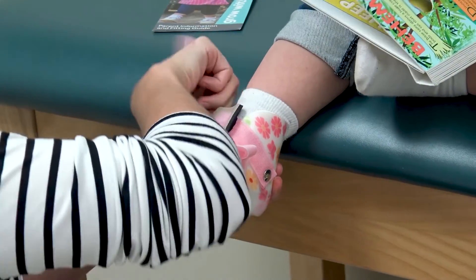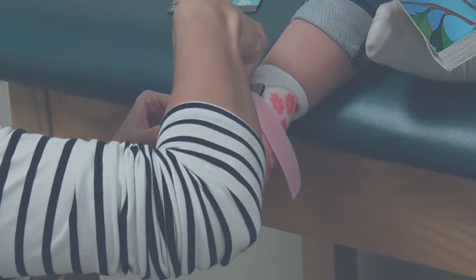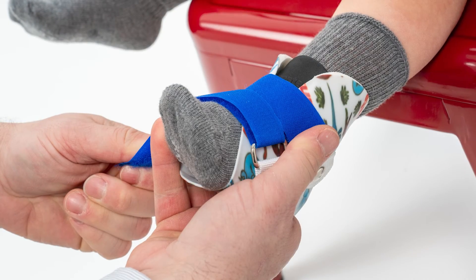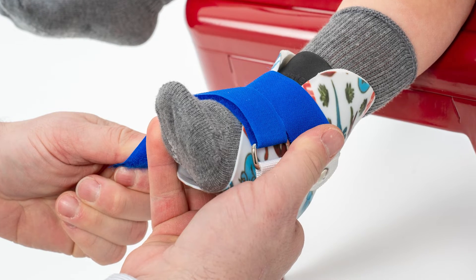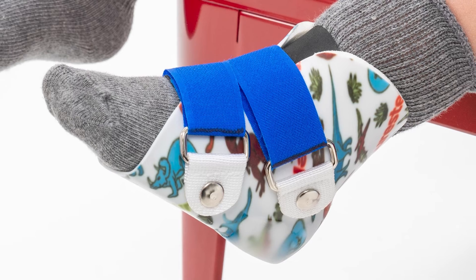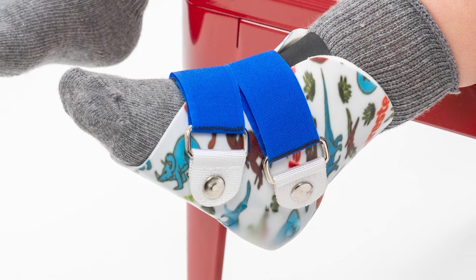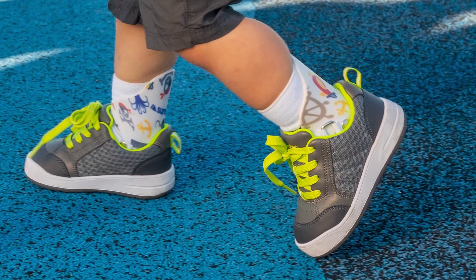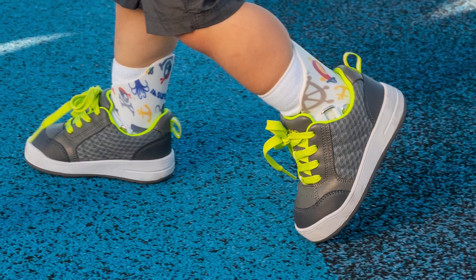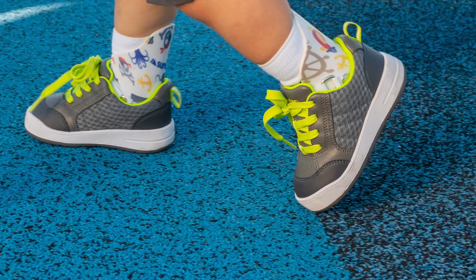We were getting very close on this. I put this SMO on Kevin and he's like, make it tighter. So I tightened it up a little bit, and he kind of slapped my hand out of the way and just cranked it tight. I was thinking that can't be comfortable. But then I took a look at what was going on and realized that it wasn't tightening it down on his foot — it was distributing that pressure around and squeezing evenly, and that felt better for him. Just a couple more iterations and we were there. We figured out the compression thing and Kevin could walk better.